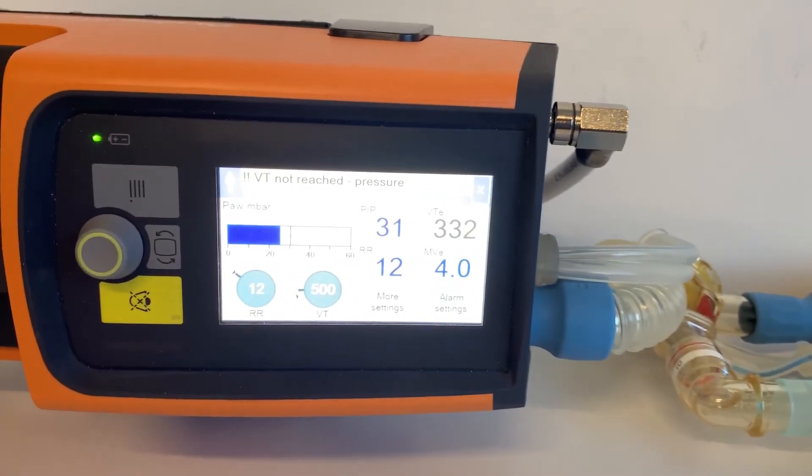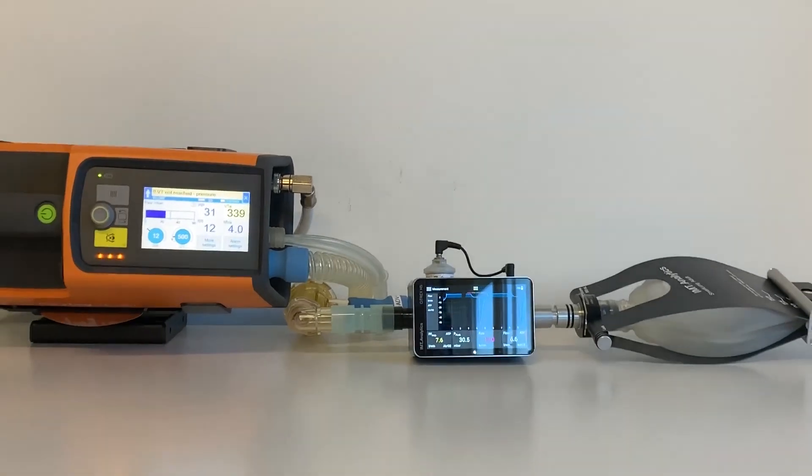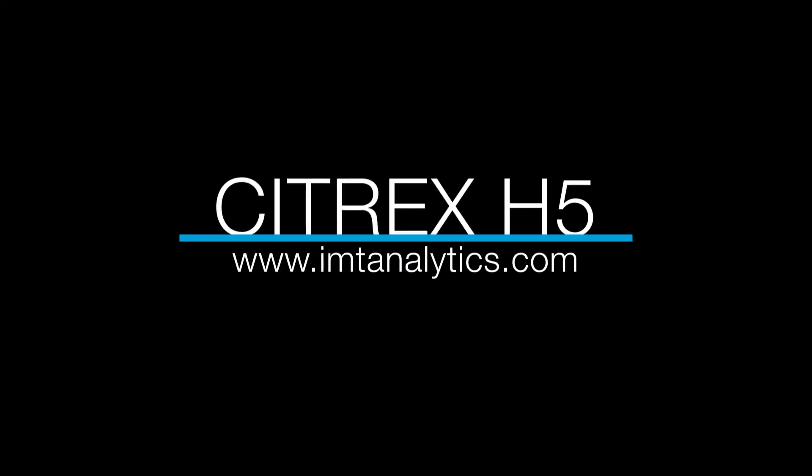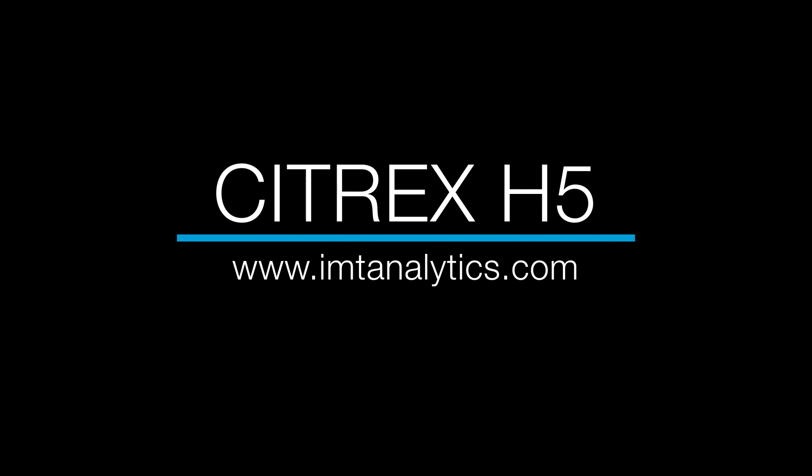With this test successfully completed, the OxyLog is now ready to use. Citrex H5: the best mobile test device in its class.